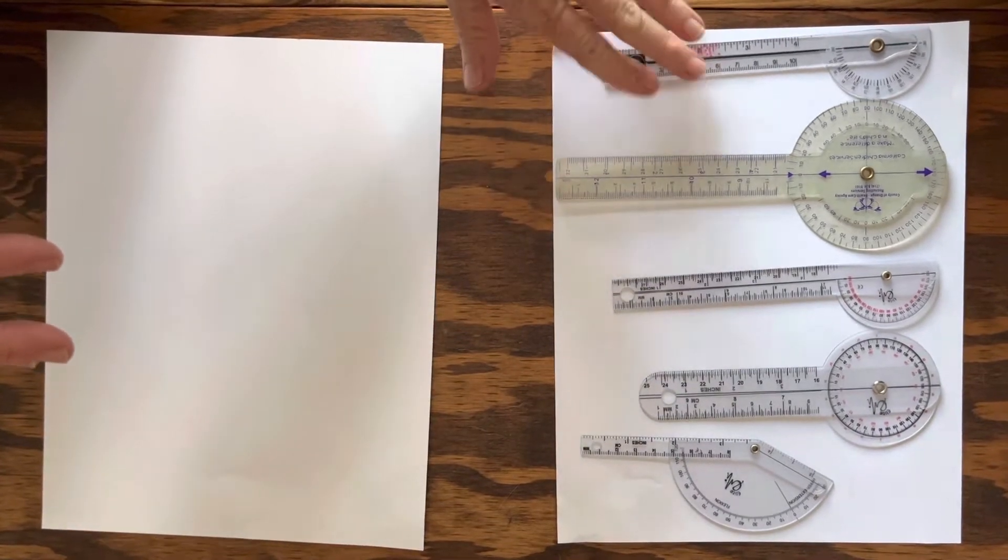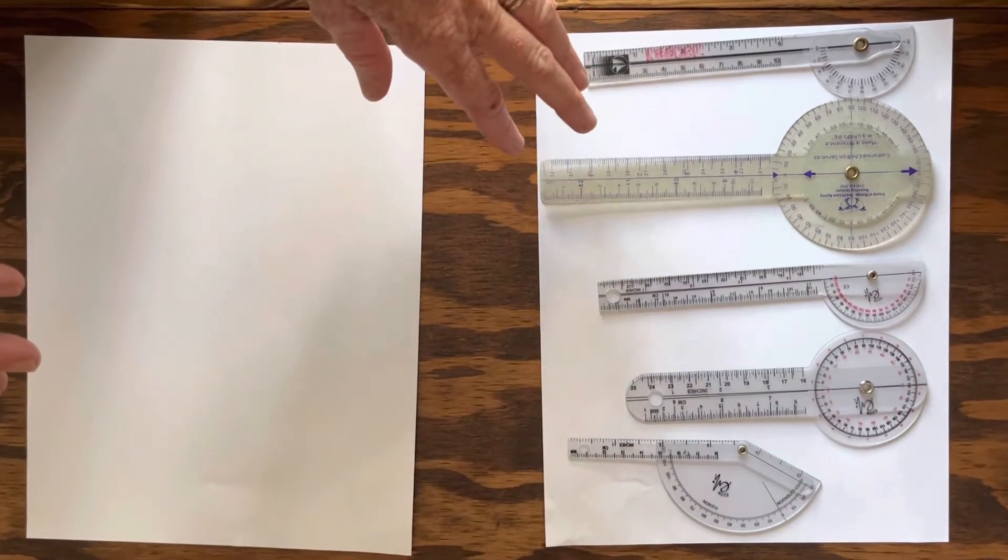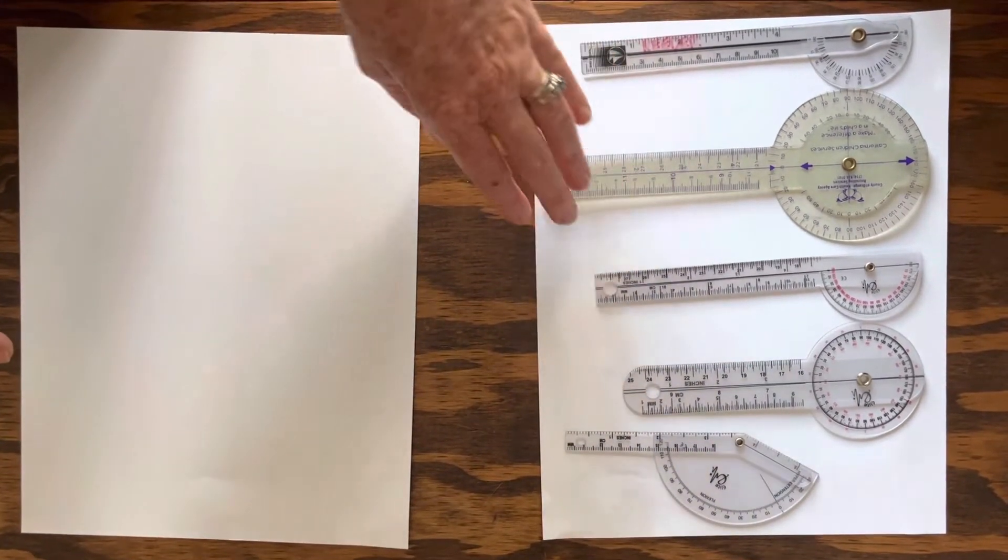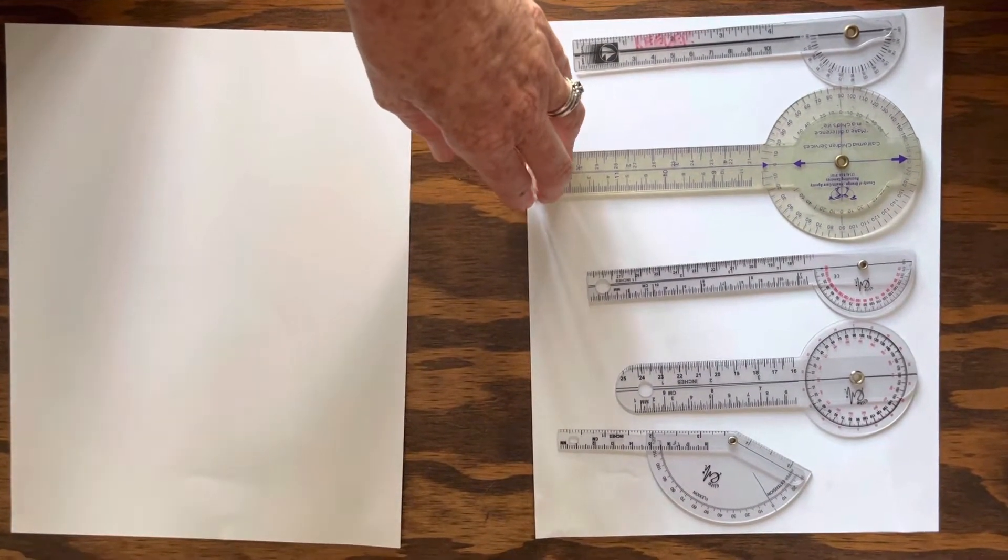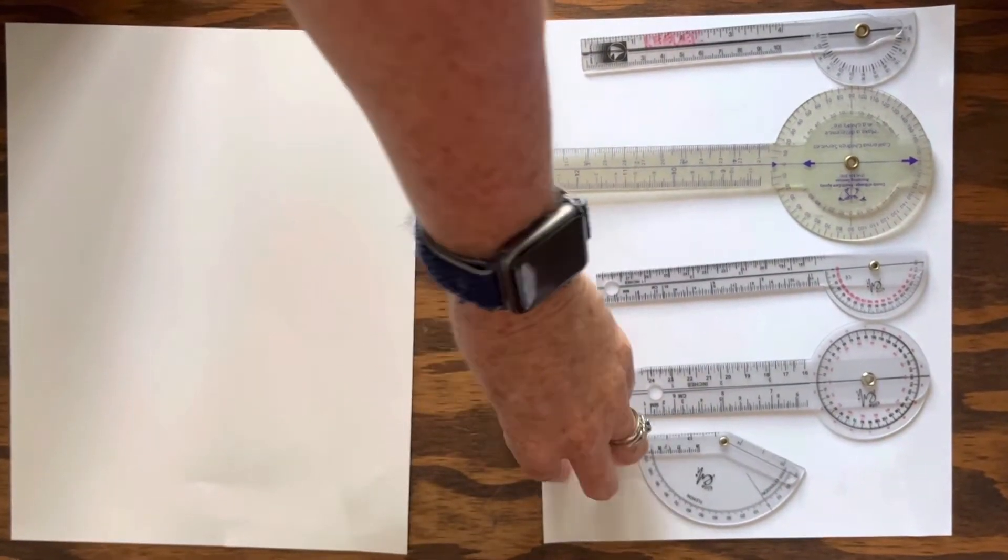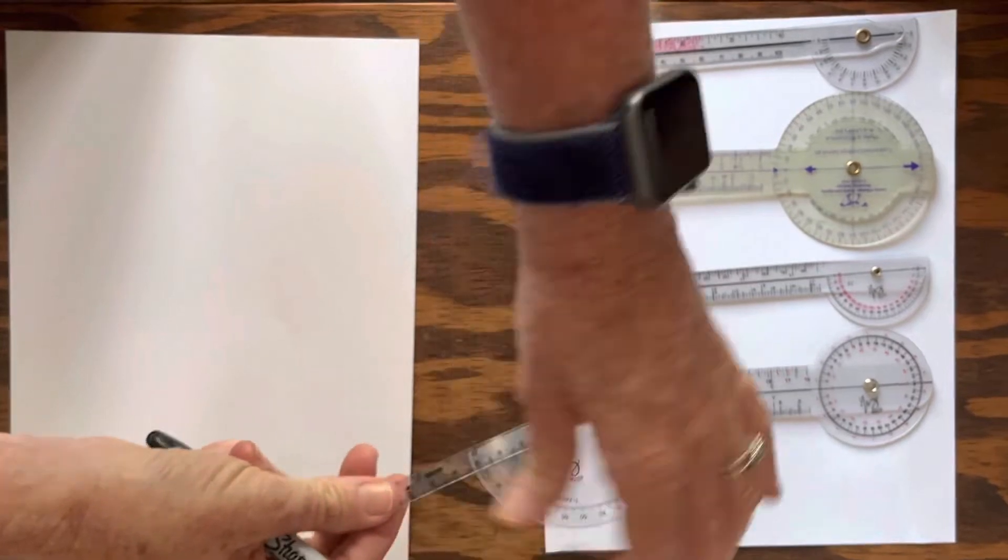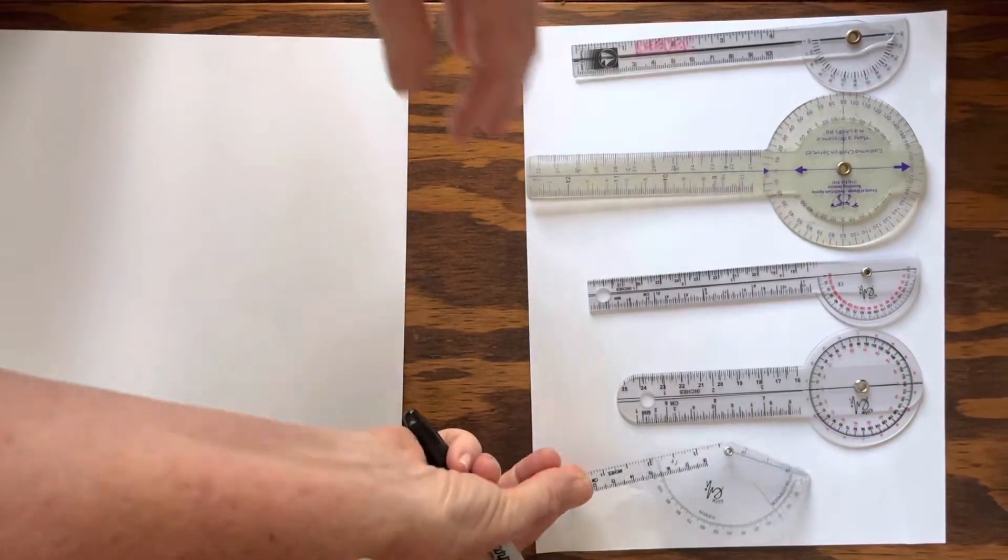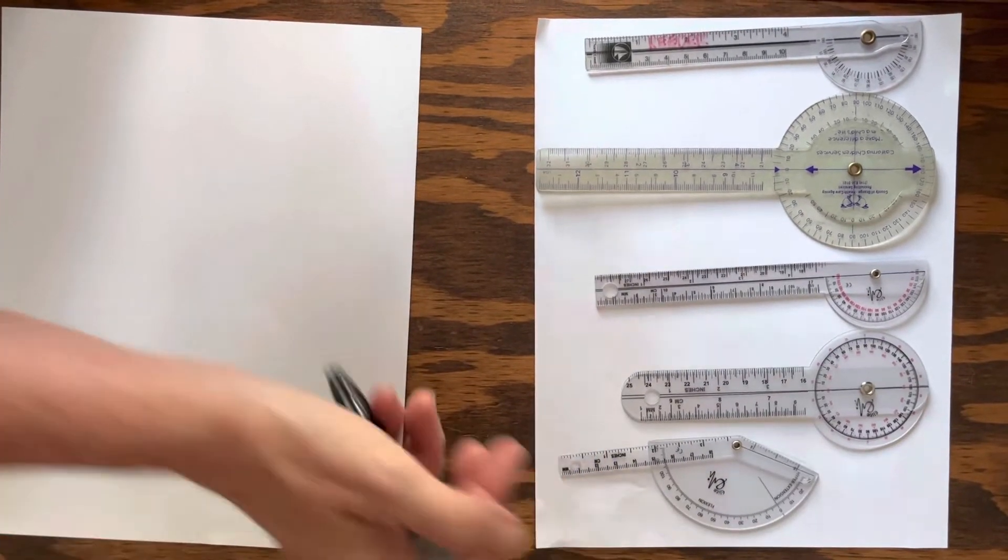The smaller ones are best for measuring those smaller joints of the hand and fingers. The bigger one is definitely better for measuring bigger joints like the shoulder, the hip and the knee. And then we have the hyperextension goniometer over here that will measure hyperextension at a joint, so it's shaped a little bit differently. You will learn more about that in subsequent semesters.